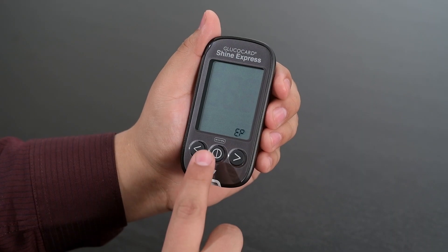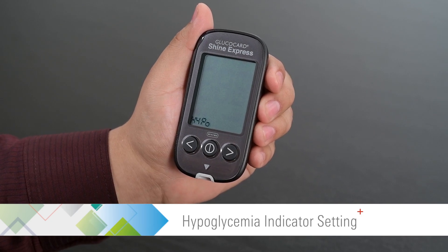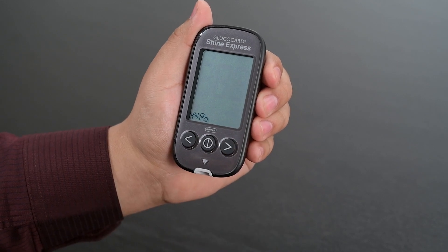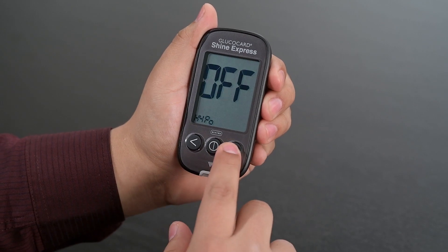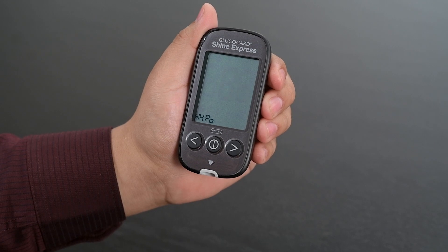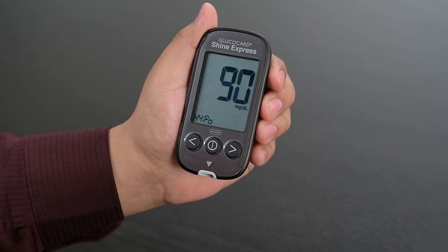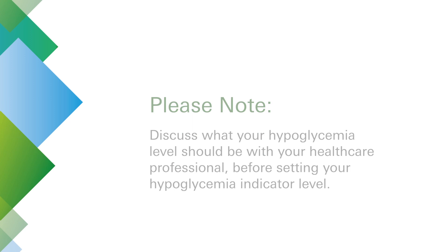Then press the center button to proceed to the hypoglycemia indicator setting. Use the left or right arrow buttons to turn on or off the hypoglycemia indicator and press the center button to make your selection. If the hypoglycemia indicator is turned on, you will be prompted to set the level. Press the left or right button to set the hypoglycemia indicator level. Discuss what your hypoglycemia level should be with your healthcare professional before setting your hypoglycemia indicator level.